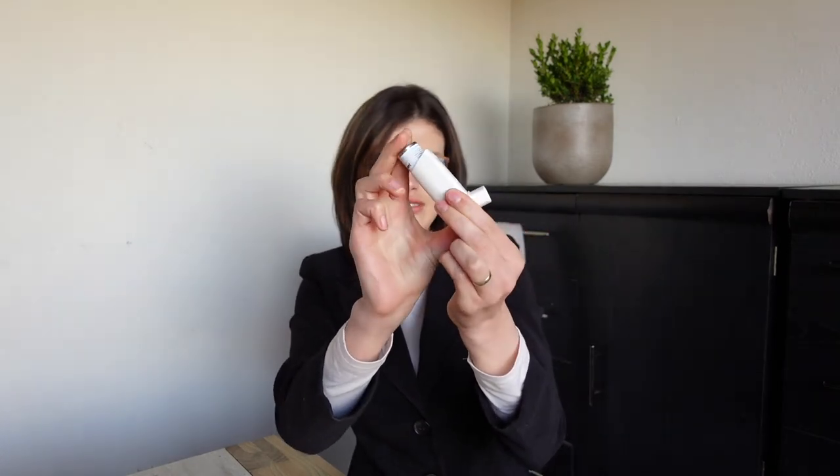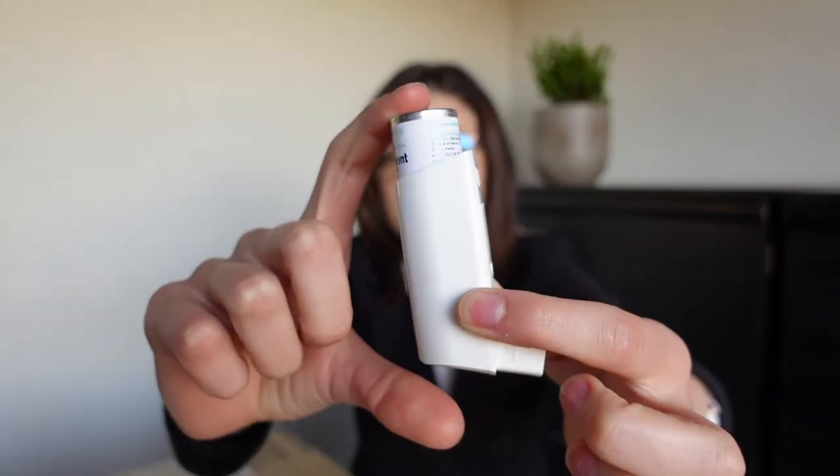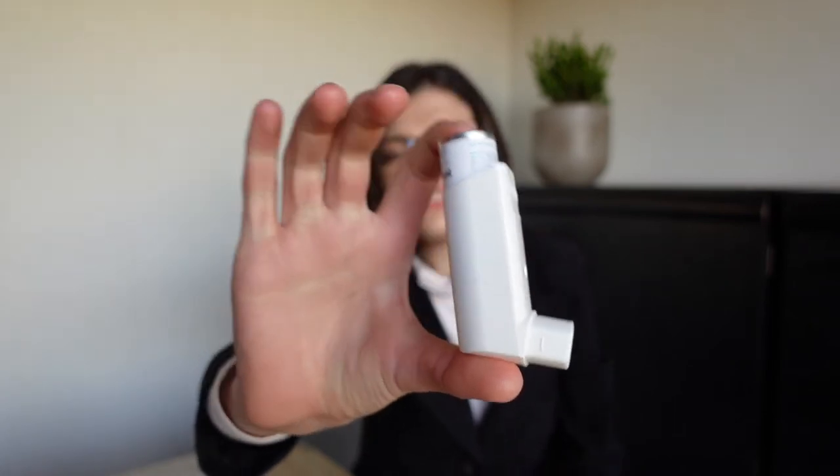You spray two sprays into the air. Now the patient is going to position the hands correctly on the device. They advise you to put your index finger here and your thumb there. It doesn't matter actually how you do it, as long as you have control when this device is put into the mouth.